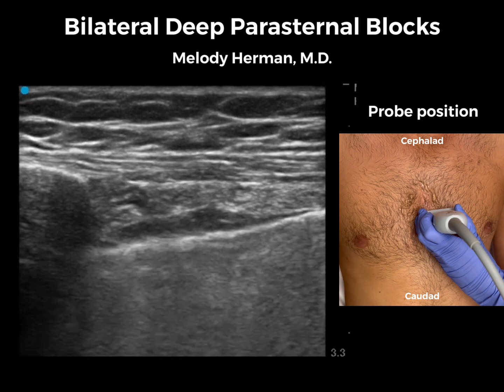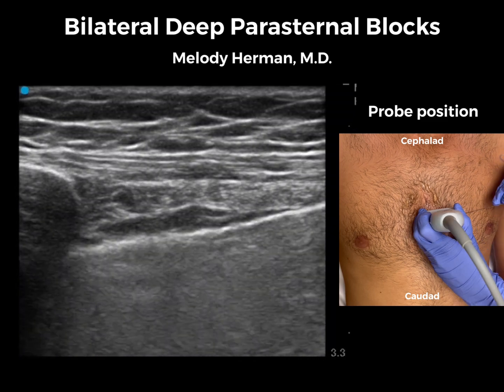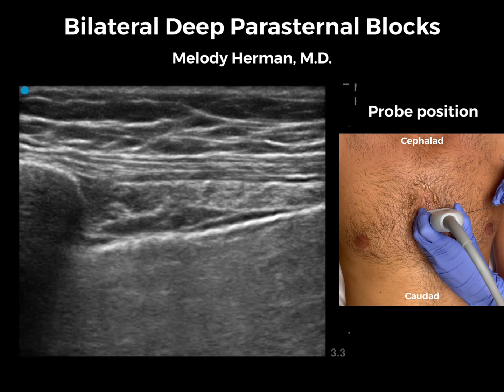The mammary vessels on the left are a little less clear than the ones on the right, so I will turn on color Doppler to confirm. The left lung does look healthier than the right side, and that makes sense because the thymoma occurred and then recurred in the right anterior mediastinum.